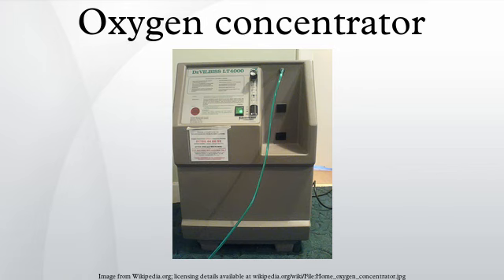Safety. In both clinical and emergency care situations, oxygen concentrators have the advantage of not being as dangerous as oxygen cylinders, which can, if ruptured or leaking, greatly increase the combustion rate of a fire. As such, oxygen concentrators are particularly advantageous in military or disaster situations, where oxygen tanks may be dangerous or unfeasible.